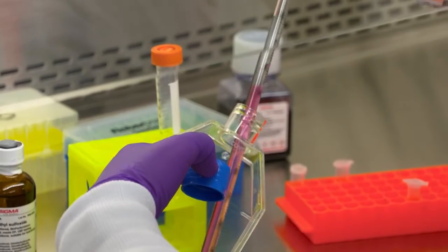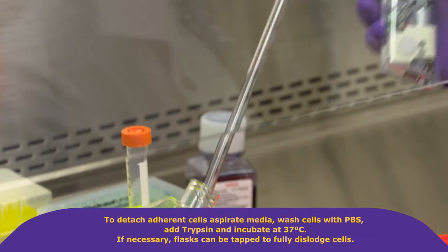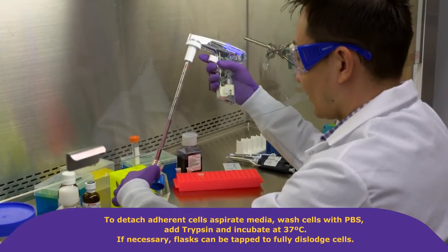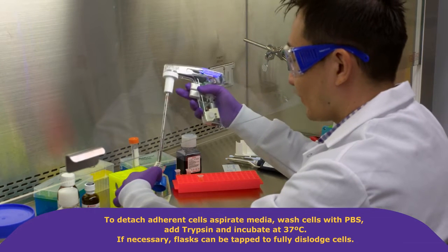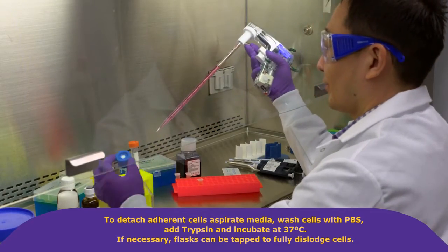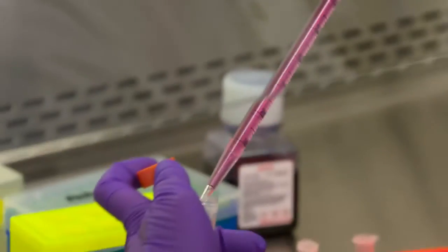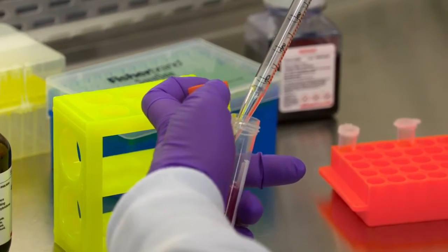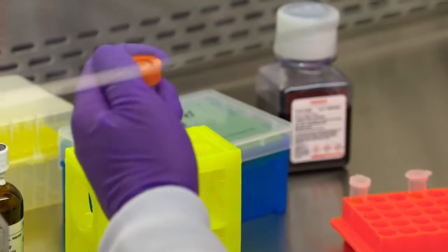To do this, aspirate the media, wash cells with PBS, add trypsin, and incubate at 37 degrees Celsius to detach. If necessary, the flask can be tapped to fully dislodge cells. Deactivate the trypsin and resuspend the cells in culture media, then transfer to a 15 milliliter conical tube.